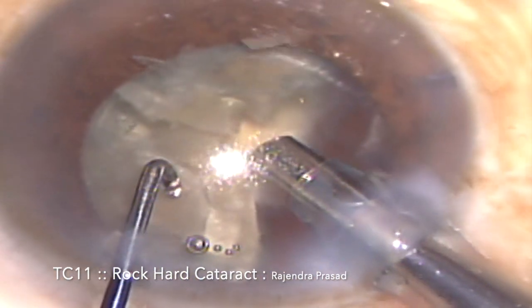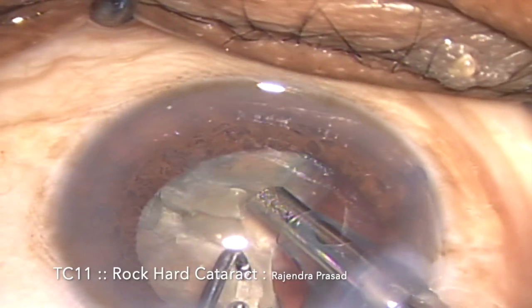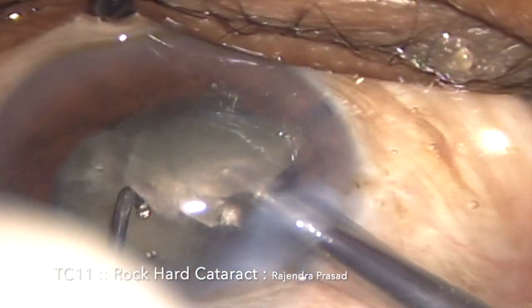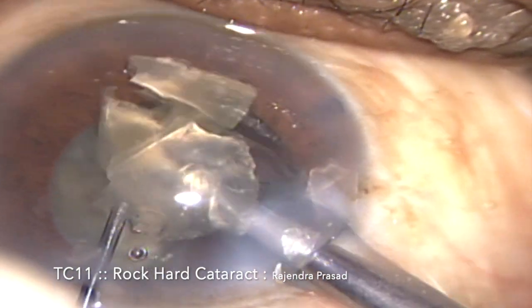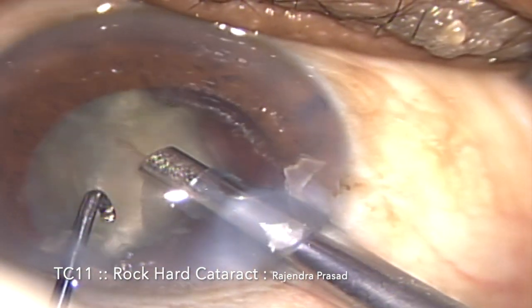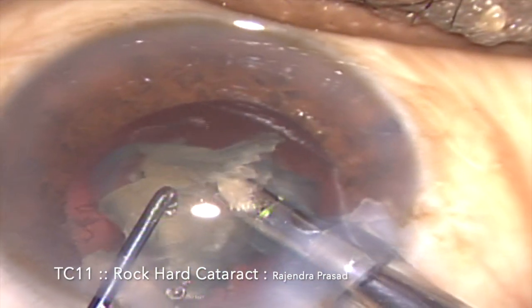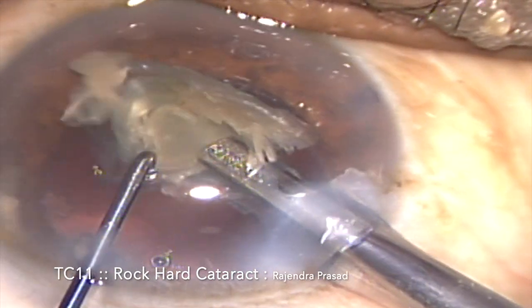This is the next segment being drawn by the FACO probe — it is also a free segment and is being emulsified. Now coming to the last piece: it seems to be a little large, so I'm just trying to sub-chop it and then emulsifying it. All three segments are being emulsified very easily, and this is the last piece which is emulsified completely.